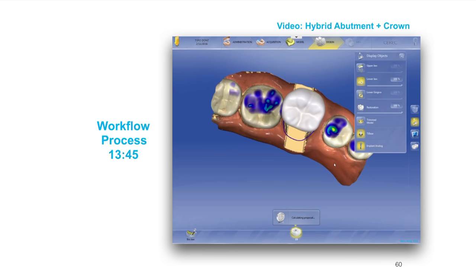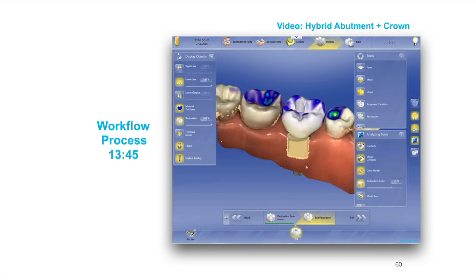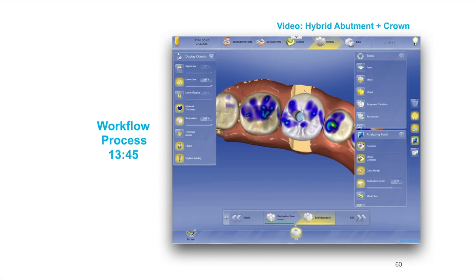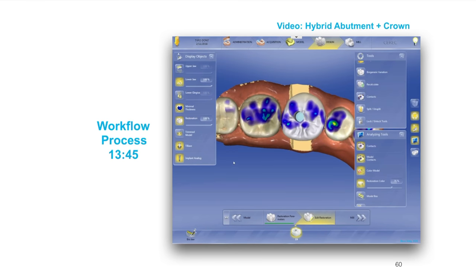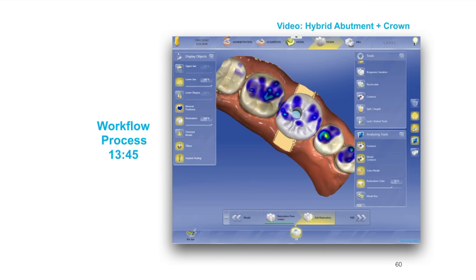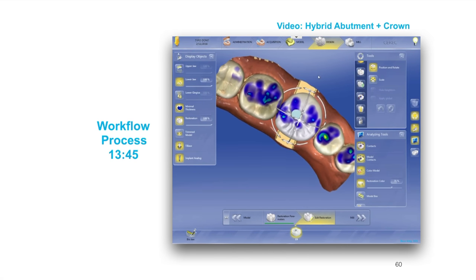It's going to give us a proposal. With version 4.4, most of the proposals are pretty good, assuming you've done all your steps right. At this point, you'll determine if you had a tie base or a scan post — if you've made an error, you'll get a big error at this point if you used one in the scanner and programmed the other. A couple of things to remember: always start your adjusting and editing from big to small. Always position and rotate first, then scale first. Never go in with a smooth tool first.